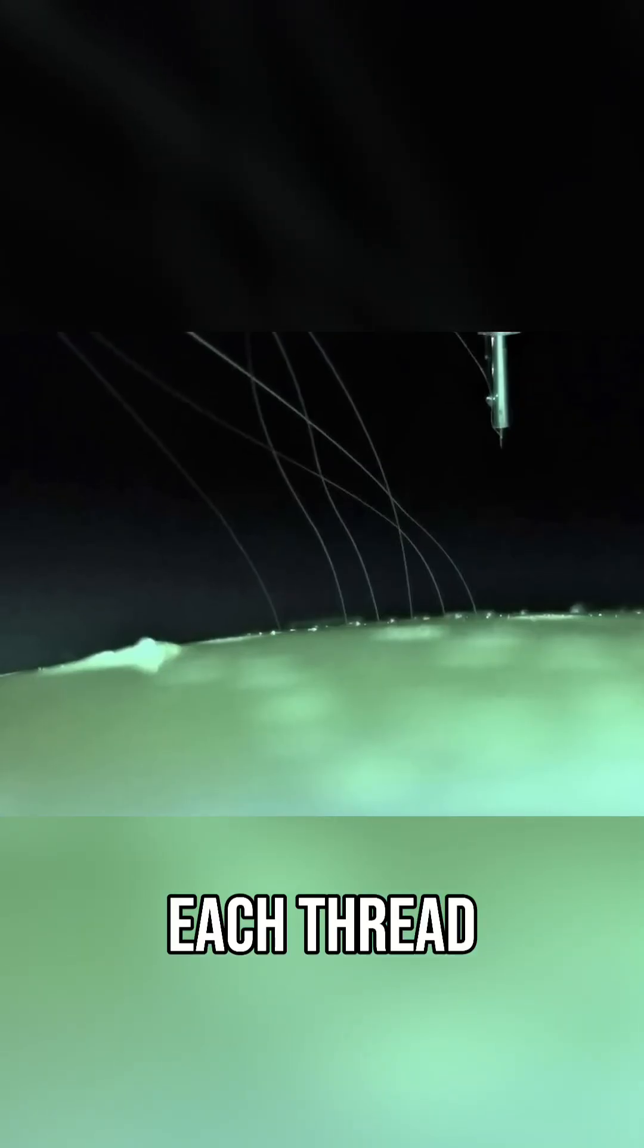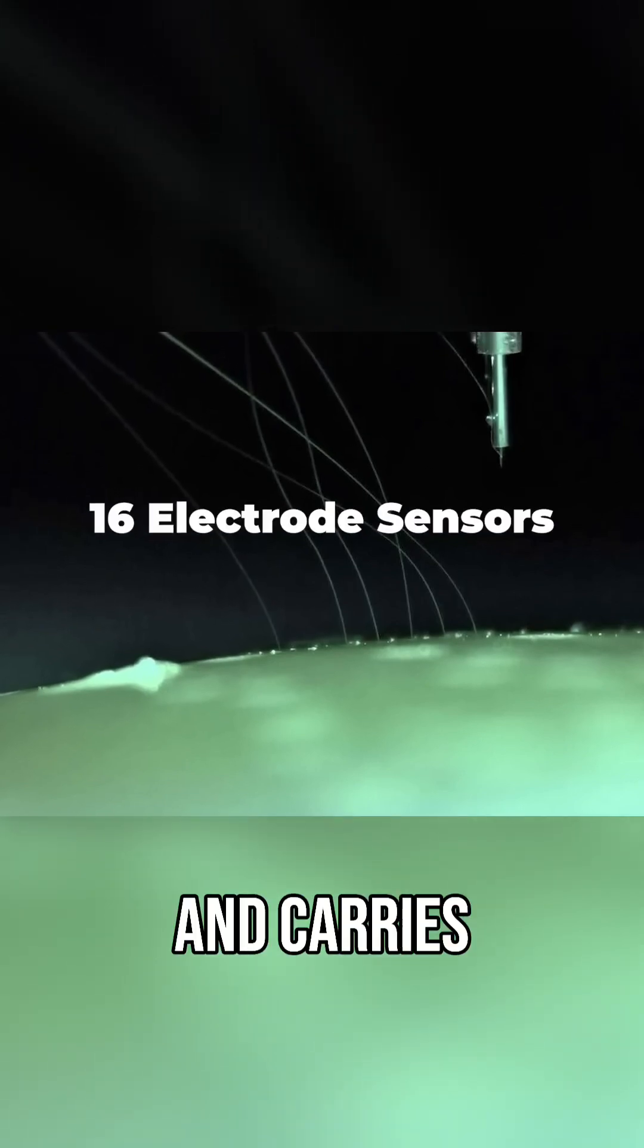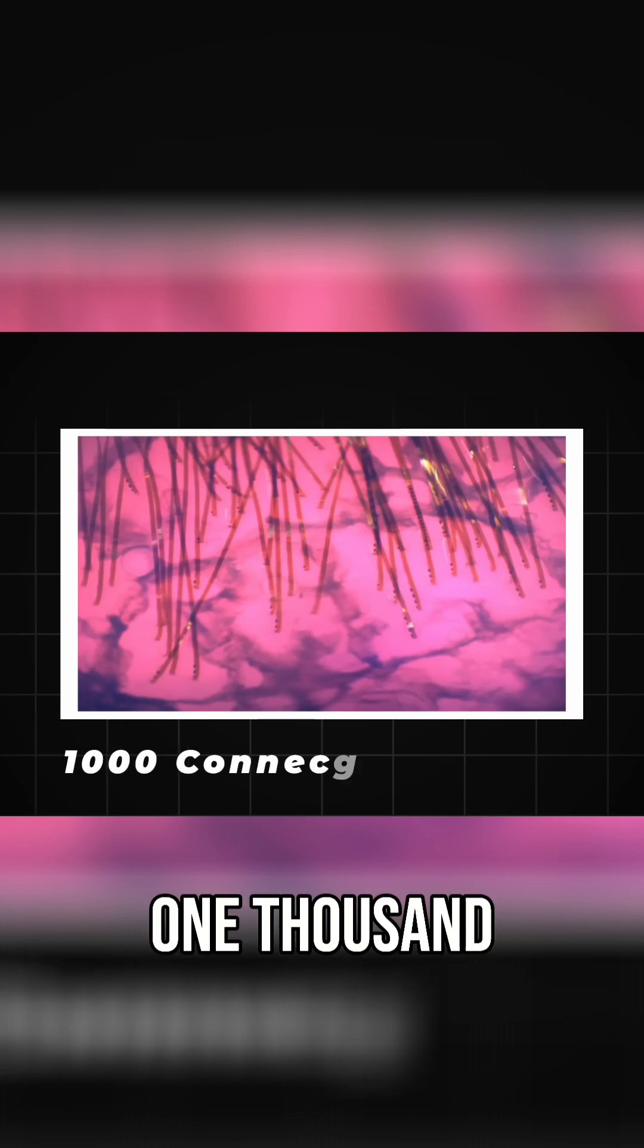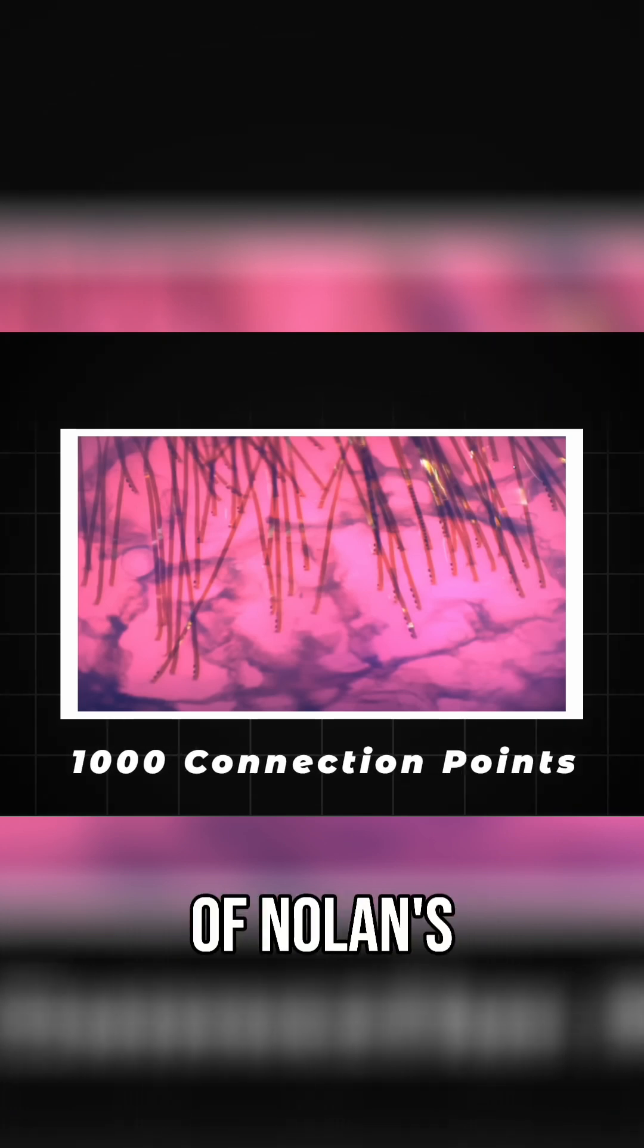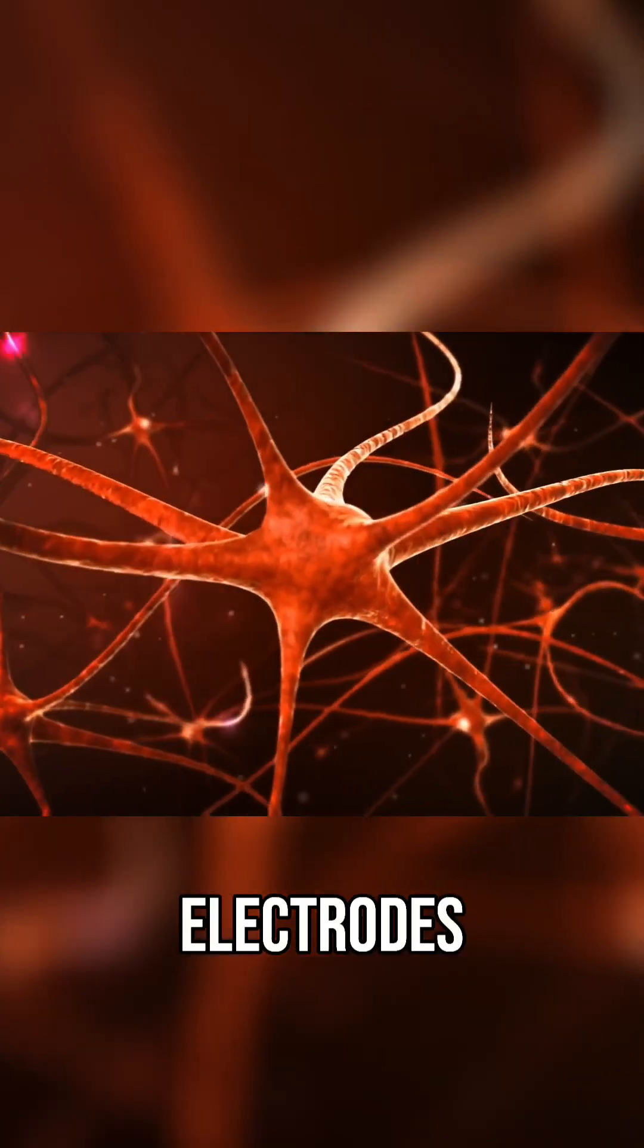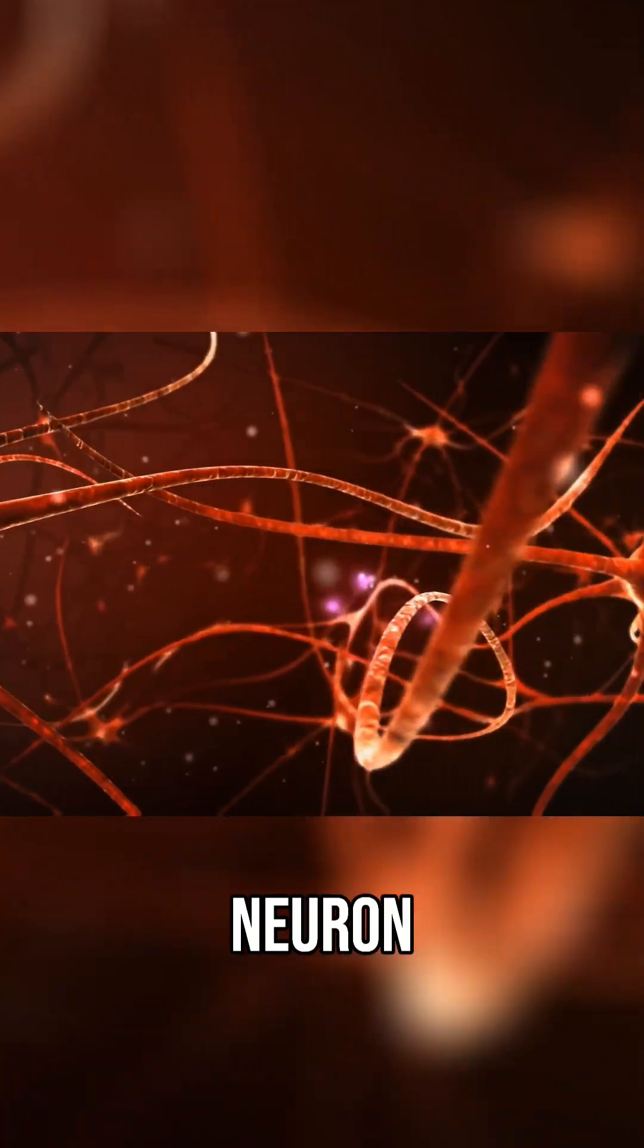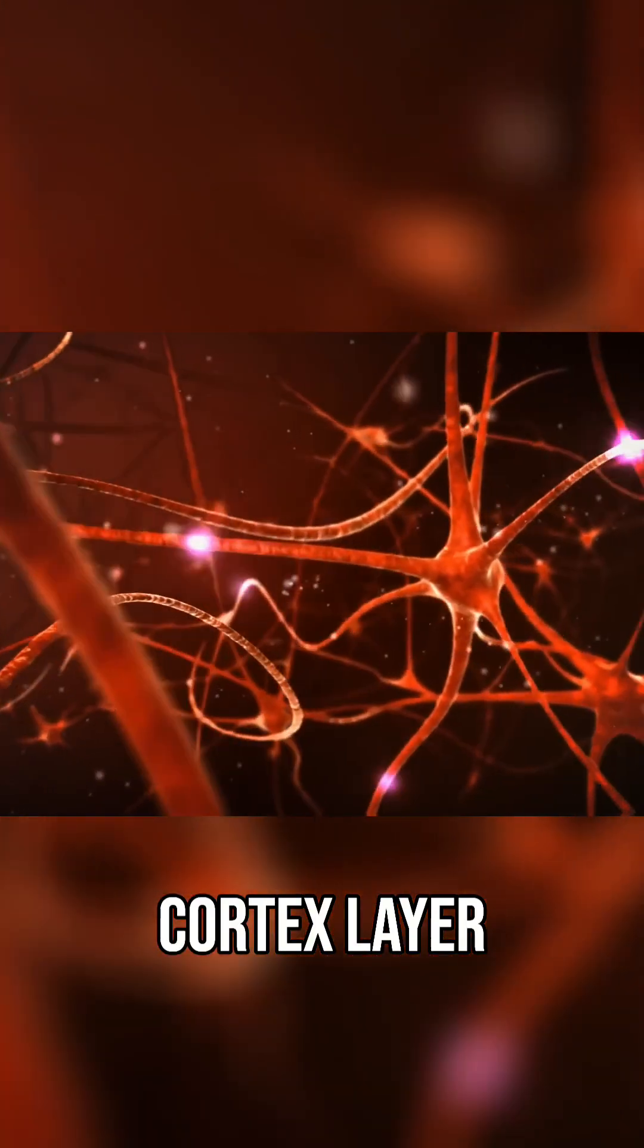Each thread is thinner than a human hair and carries 16 electrode sensors, giving the link device a total of over 1,000 connection points into the neural network of Nolan's brain. From here, the electrodes can detect bioelectric pulses created by neuron activation within the cortex layer.